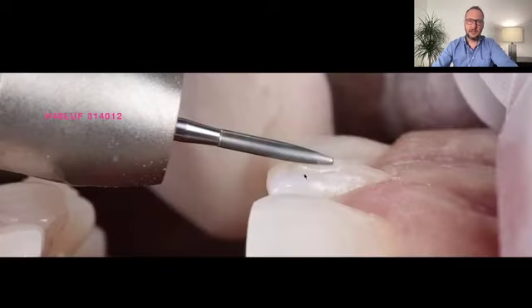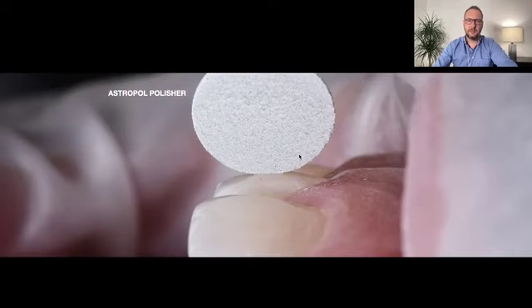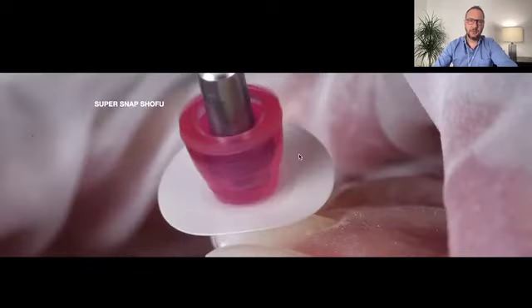And again use the K-light. And here you can start using this other burr, this here, okay, with this reference that you can check back later, so you can remove without being so aggressive to the enamel, and then K-light and removing, K-light and removing. This way, and then start polishing. This is the best way for you to remove attachment.